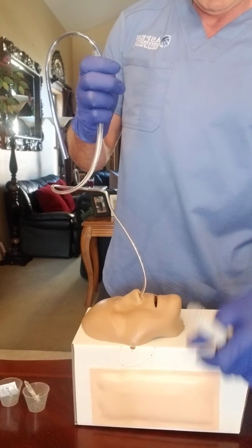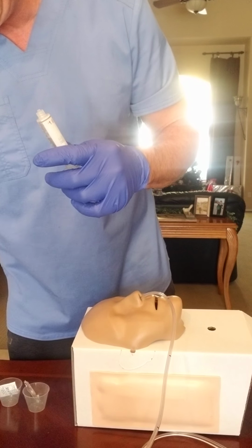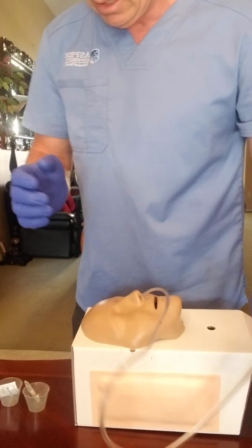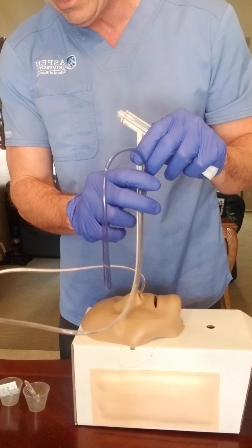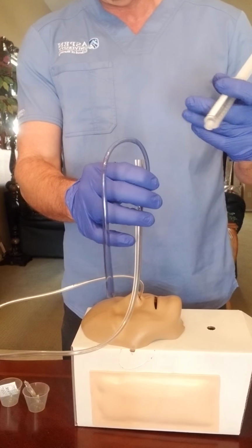I'm going to put the cap back on, and I'm going to test the pH of the gastric fluid, and it tests normal, about 5.5 pH.